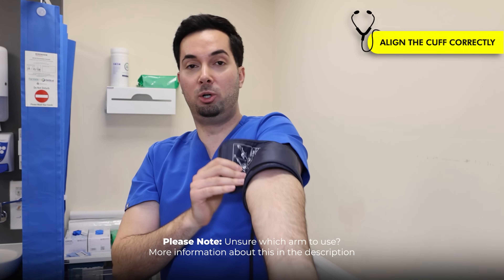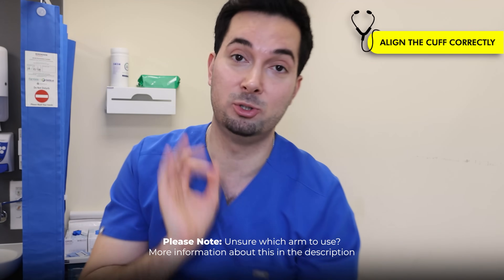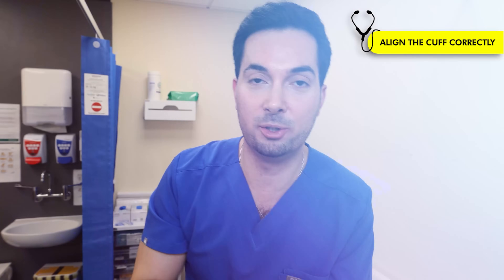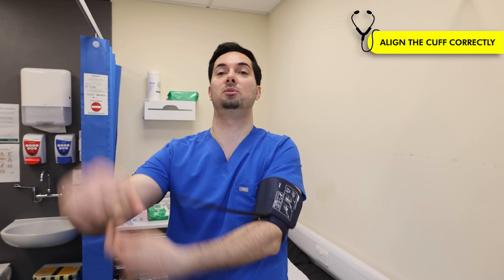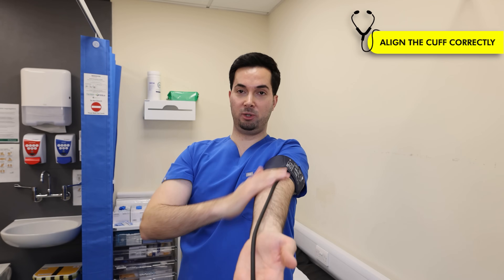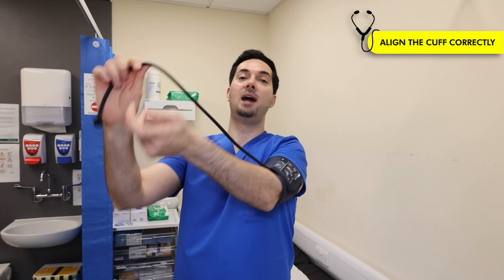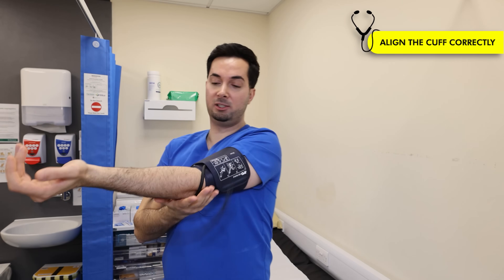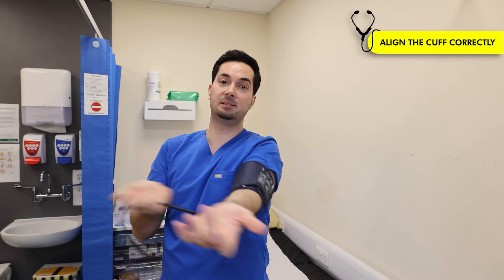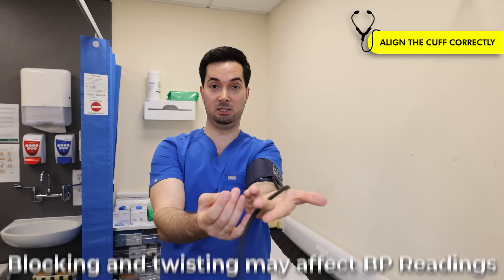Make sure you're putting the cuff on correctly to avoid inaccurate readings. Another important point: when you've got your cuff on and you're taking a reading, always run the tube down along your arm and then connect it to your blood pressure monitor. I've seen patients run the tube underneath their elbow where it gets pushed against a table and the tube gets blocked, giving inaccurate readings. Always run it along the arm.